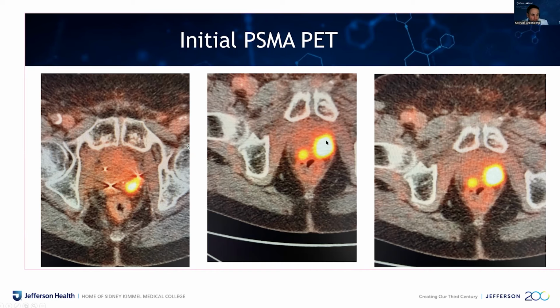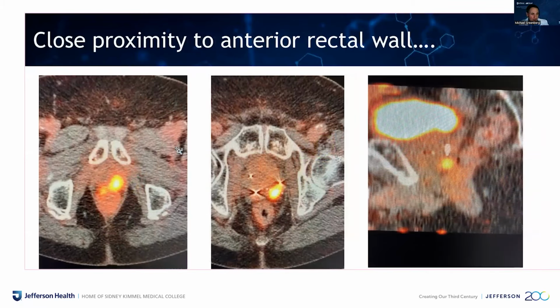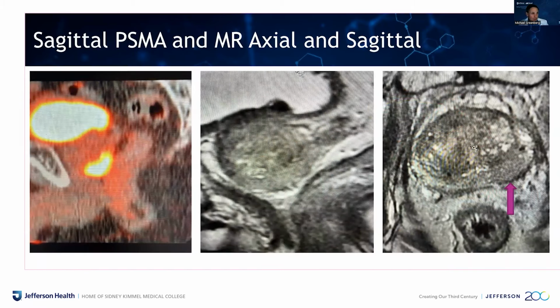And you can see he has two posterior lesions, one on the right side. Remember, we're looking at mirror images, and one on the left side going posteriorly to mid and central gland. Fairly large volume. Coming down, it went all the way down to pretty much at the apex of the prostate. And the last slide on the right is looking at the tracer of one of the lesions from right to left, or a sagittal image. So there's the sagittal image, and the third slide, the slide which is the furthest to the right, you can see one of the lesions, the gray area in what we call the peripheral zone of the prostate.